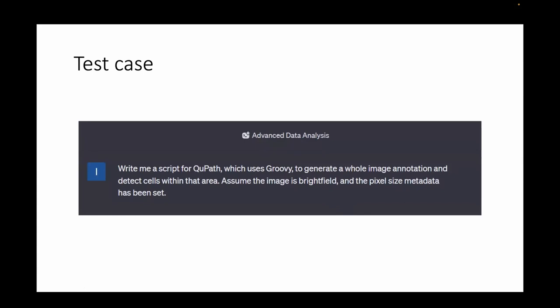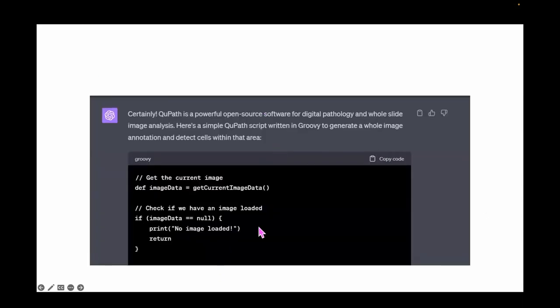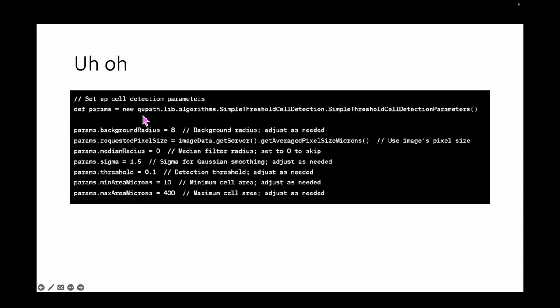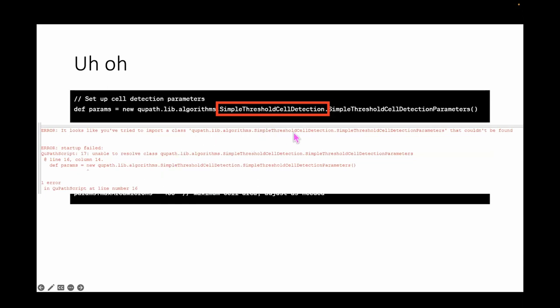In QuPath specifically — my test case: I said 'write me a script in QuPath which uses Groovy to generate a whole image annotation, detect cells within that area, assume the image is brightfield, and set the pixel size metadata.' It knows what QuPath is — good start — and has a simple Groovy script written for what I asked. It does 'image_data = getCurrentImageData(),' checks to see if we have an image loaded. But looking at the next bit, it uses 'simple threshold cell detection' which immediately throws an error.